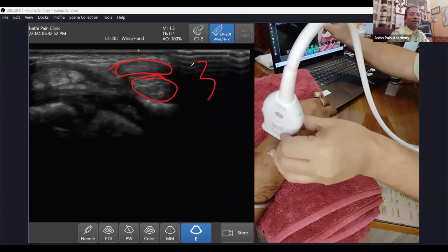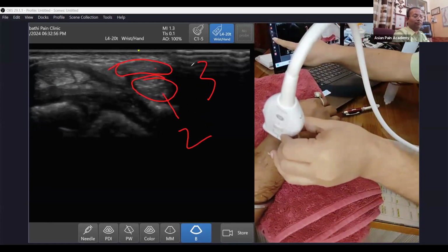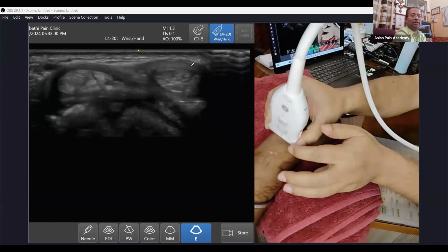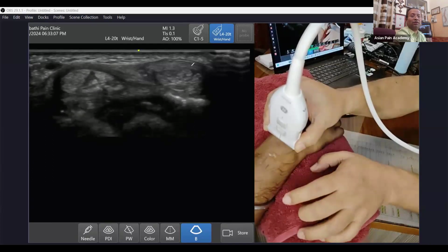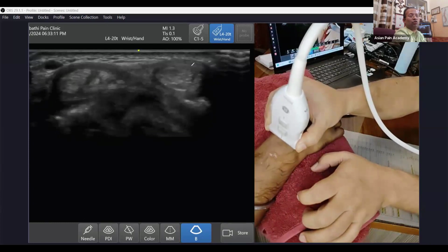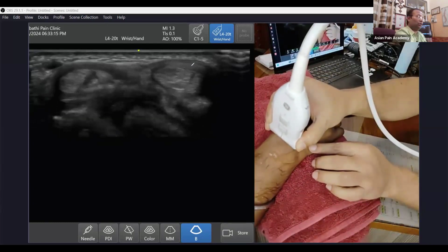This is the ECRL ECRB tendon. You can see, this is also an area where one tendon rubs another tendon, and this is the area for distal intersection syndrome. So two intersection syndrome areas I have already talked about.